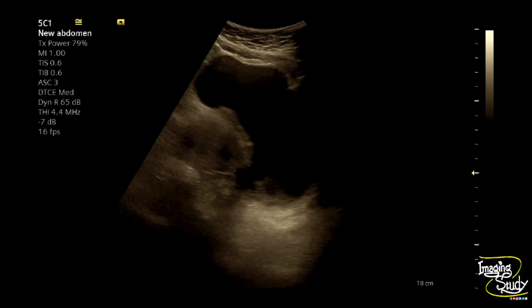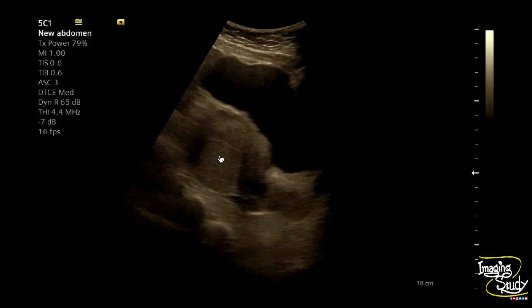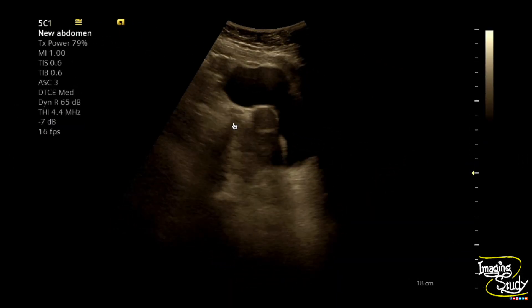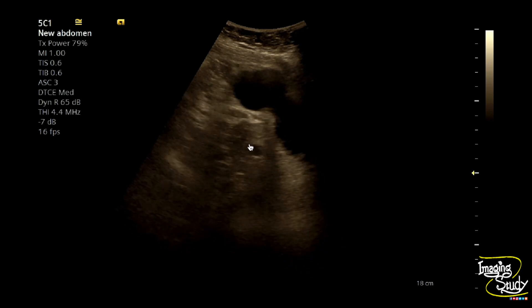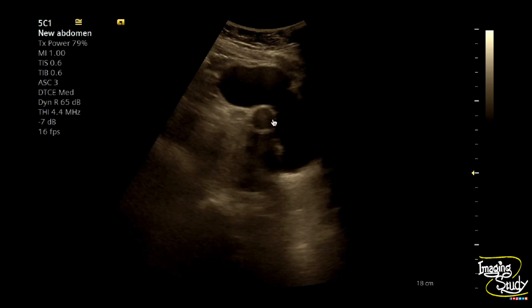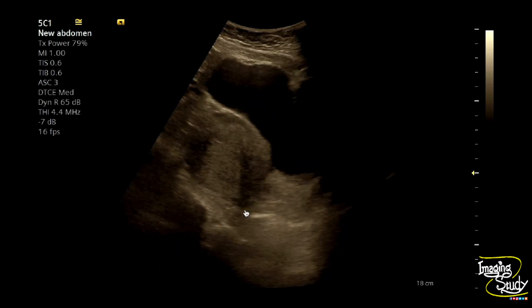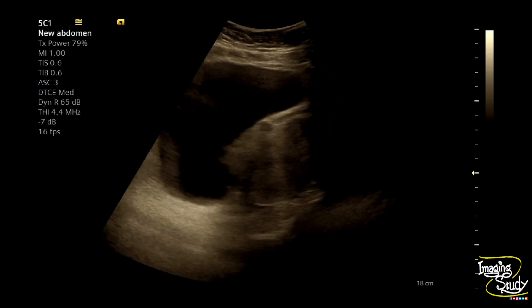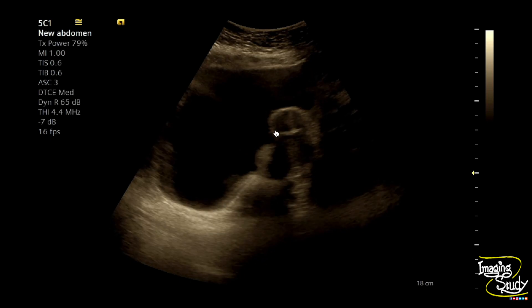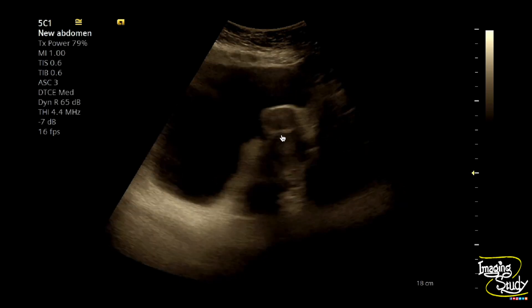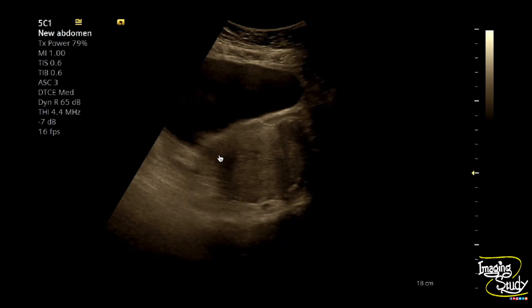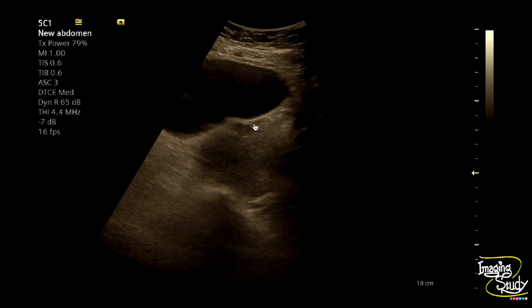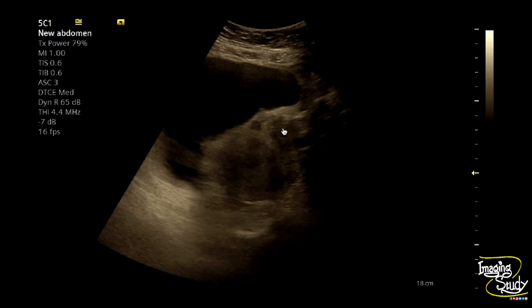Here's the longitudinal section of the uterus. You can see multiple hypoechoic areas within the myometrium. One is indenting towards the perimetrium, indicating a subserous fibroid. There are a few more within the anteromyometrium. So primarily this is a case of fibroid uterus.